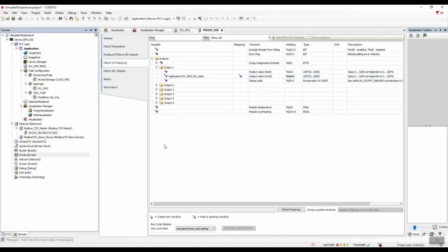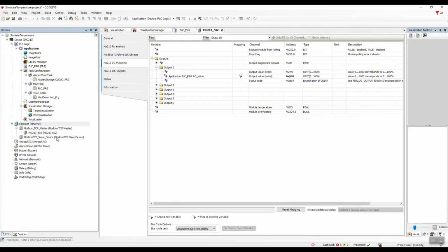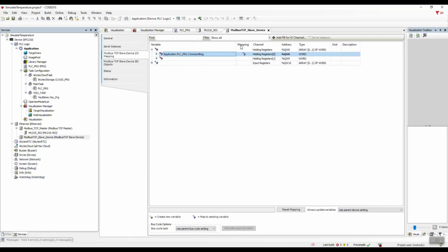Next, let's make SPC210 a Modbus TCP slave device. To do this, add a Modbus TCP slave device from CODESYS to the Ethernet device. In my project, this has already been done. In the General tab, check the writable box for the holding registers area. Write in the comments what this setting is for. Next, in the Input-Output Mapping tab, we link the emulator command variable to the channel, holding register 0.